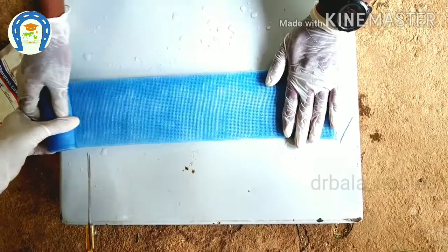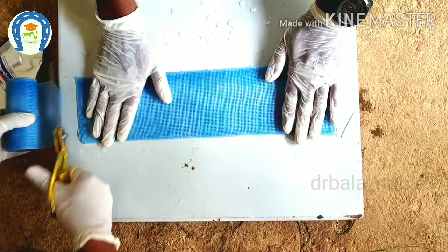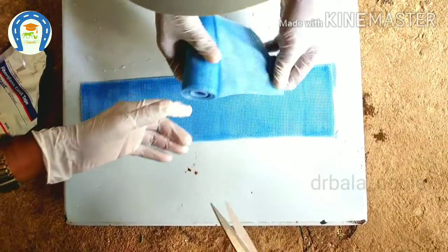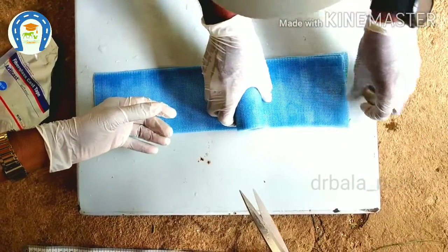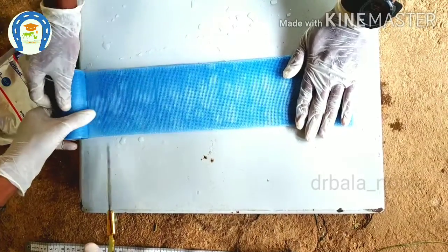This fiberglass material is very lightweight, more durable, more water resistant, and more easily penetrated by X-rays. The thickness of the splint is based on the body weight of the animal and the location where it is applied.